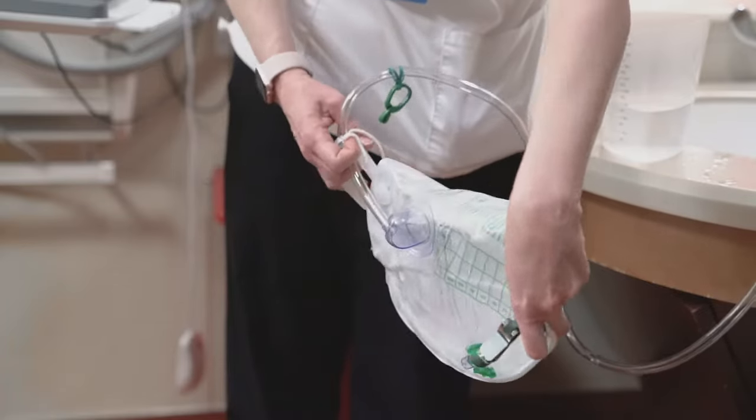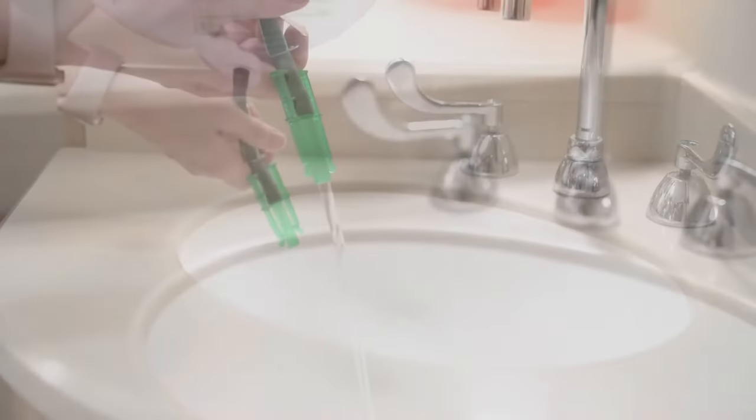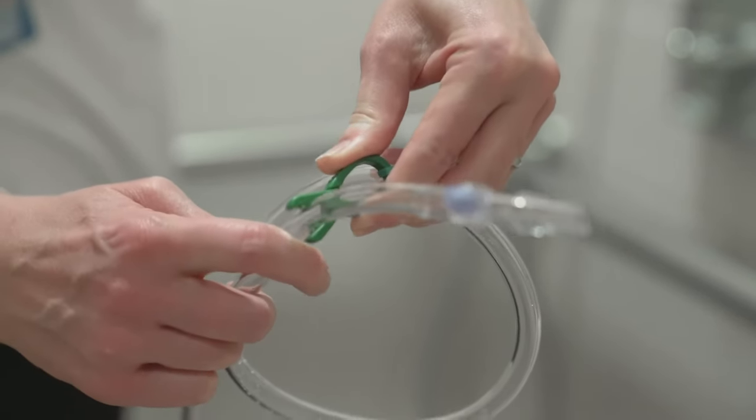Shake the bag to make sure the solution covers all areas of the bag. Leave the solution in the tubing and bag for a few minutes. Empty the bag and rinse it out with cold water. Hang the bag and tubing in a clean, dry place.